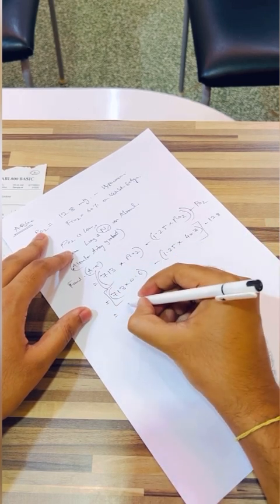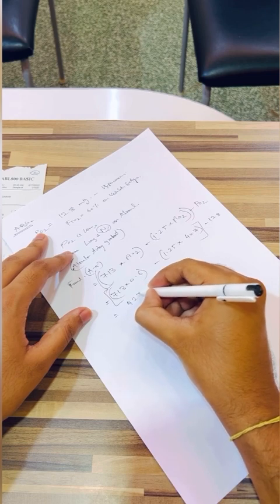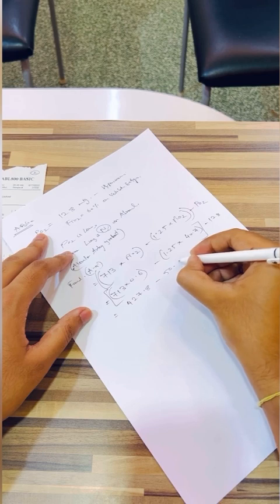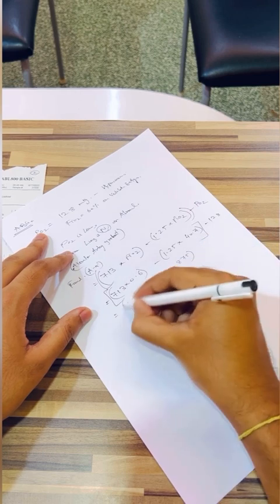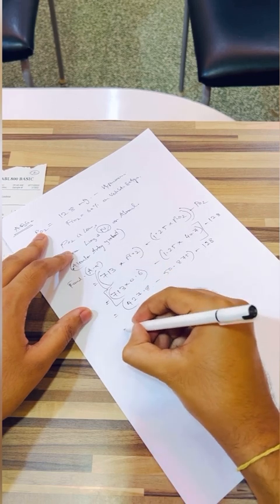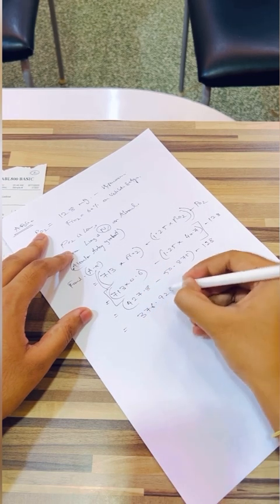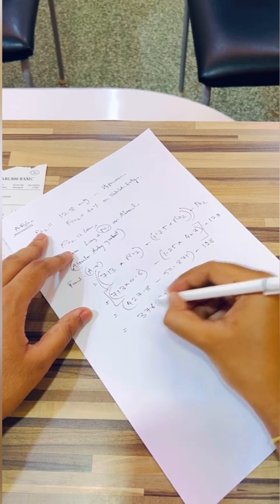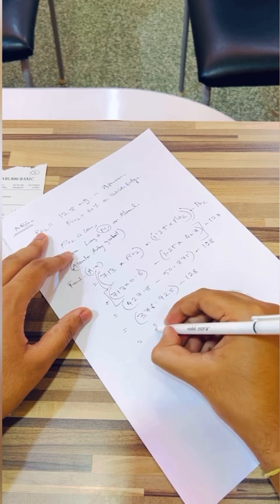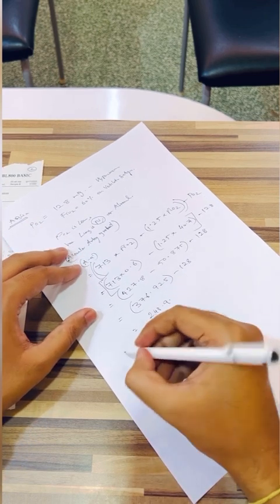I have already calculated the values for the time being. 427.8 minus 50.875 and minus PO2, which is 128. So this is 376.925 minus 128, and if we subtract, the value comes around 248.9.